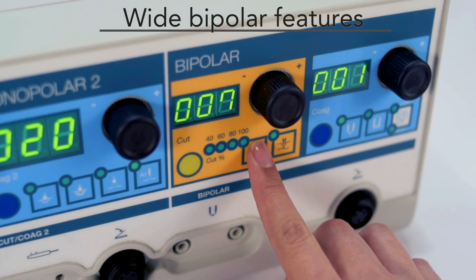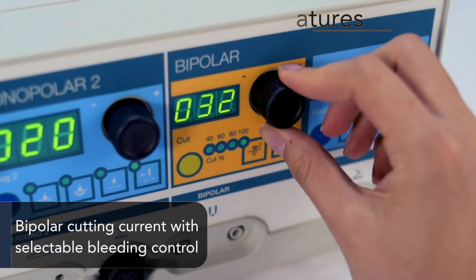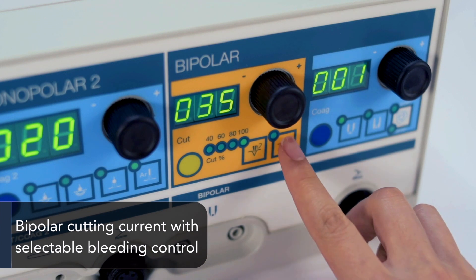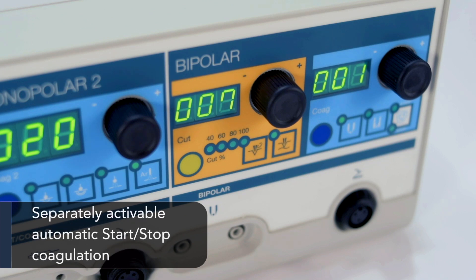Wide bipolar features include bipolar cutting current with selectable bleeding control, slow blend cutting current, and separately activable automatic start/stop coagulation.